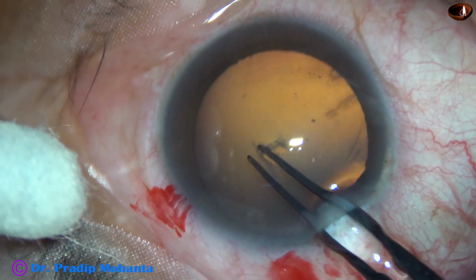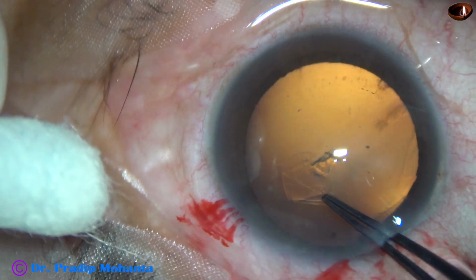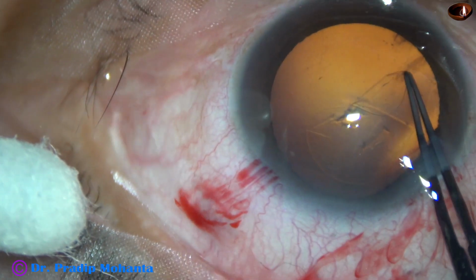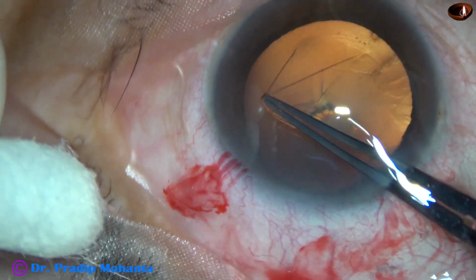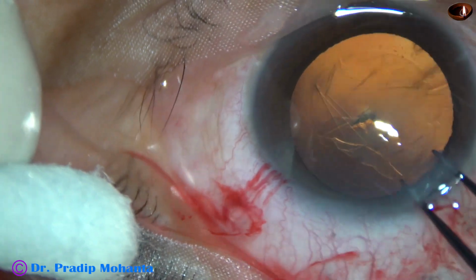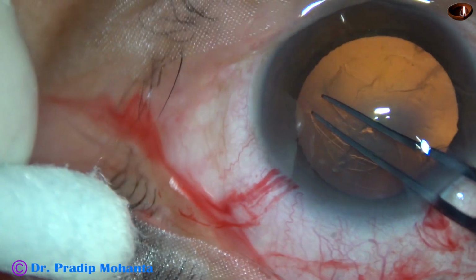A utrata forceps is being used to make a puncture at the center of the capsule, raise the capsular tag, and use this capsular tag to do a continuous curvilinear capsulorhexis.